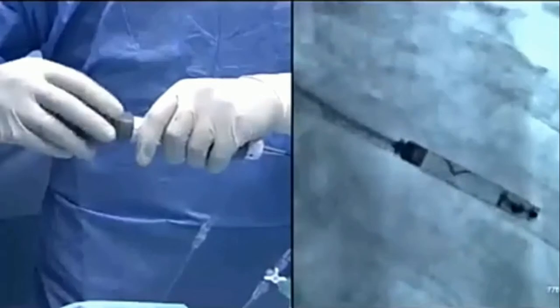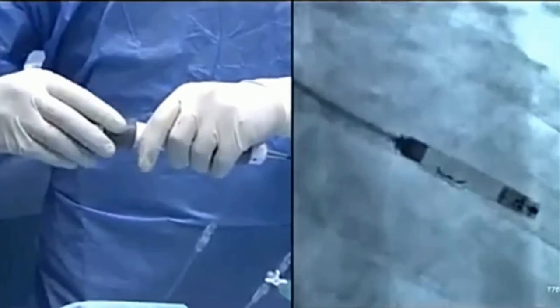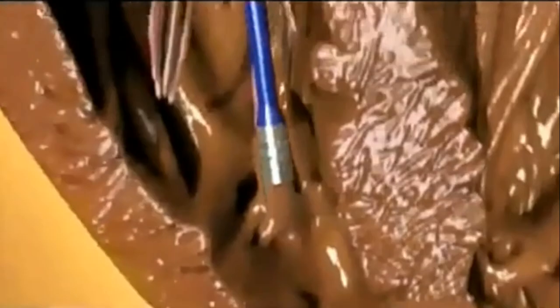The pacemaker contains a radiopaque arrow that can be seen under fluoroscopy and used to guide the rotation of the pacemaker. The delivery catheter is then detached from the proximal end of the pacemaker, the tethering wires are disconnected, and the delivery catheter is withdrawn.